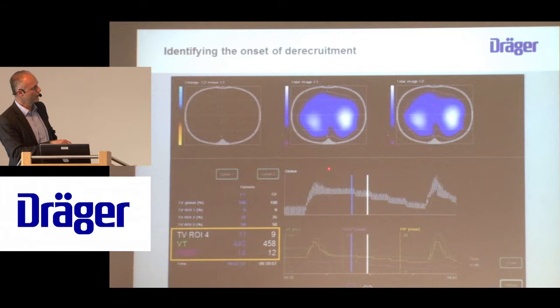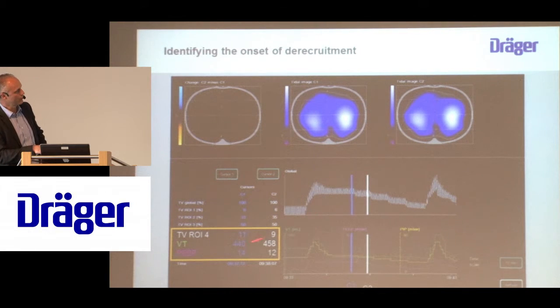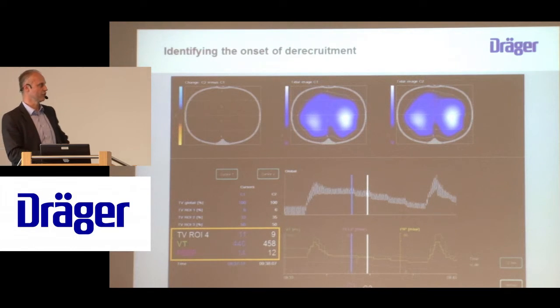Here we had a decrease of the driving pressure at the highest PEEP level, but still we had 11% of ventilation. And when you go down now and compare the PEEP level of 14 with the PEEP level of 12, this differential image remains black, which means there's no substantial decrease of dorsal ventilation.